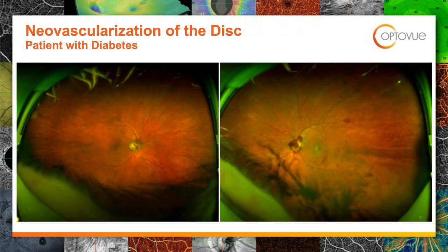Here was a neat patient that came in. This was neovascularization of the disc. This patient is with diabetes. Long story short, he stopped his diabetic insulin medication to try to increase his blood sugar to help him put on weight. If you look at the right eye there, it looks pretty good, but if you look at the left eye, there's some hemorrhaging. Is there neovascularization going on?